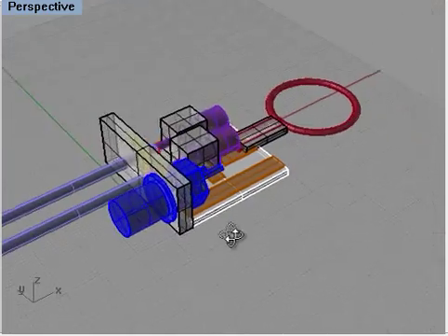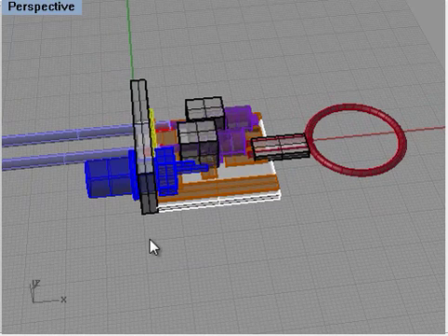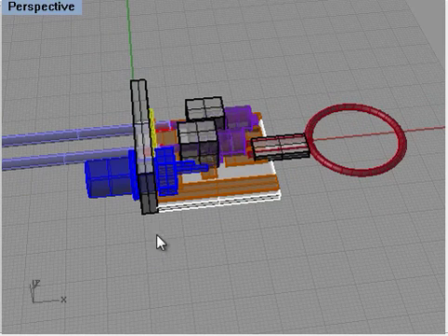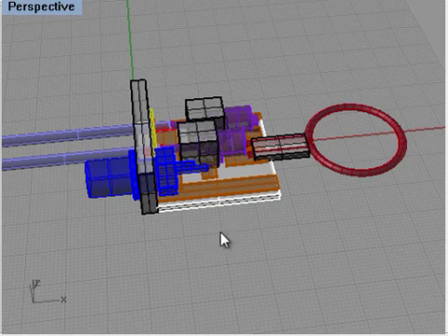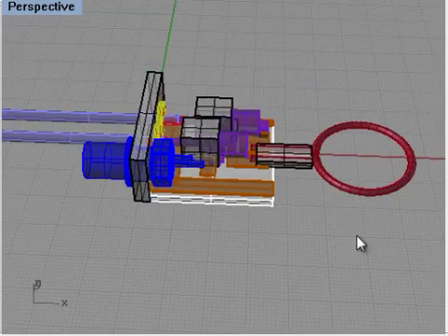In dimensions, I don't know how well you can see these squares, but each large square here is 1 centimeter, and the very minute squares are 1 millimeter. So 1, 2, 3, 4. This is about 4 centimeters long. So this whole design here is about 6 or 7 centimeters long.